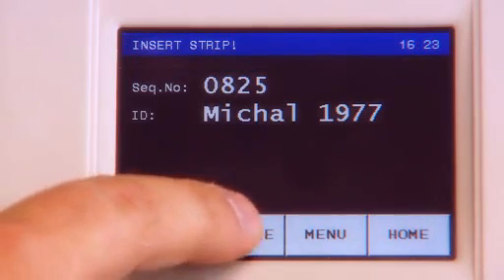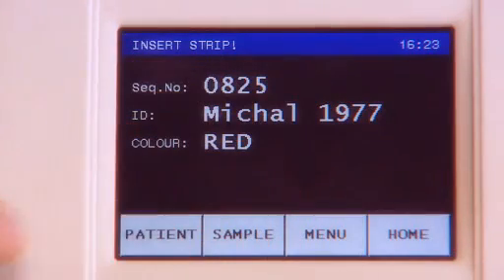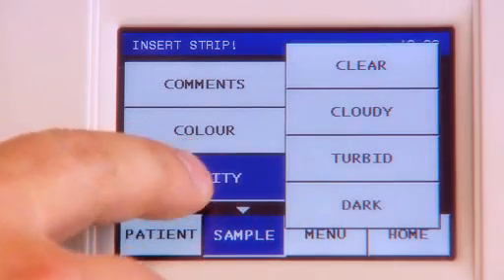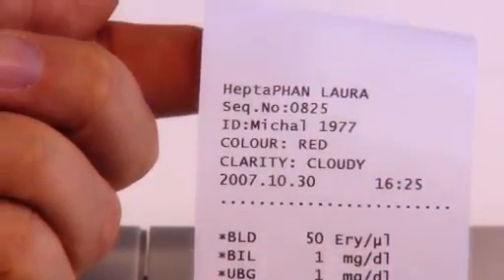The machine has a rich user interface and colour touchscreen, which allows maximum adjustment for the individual requirements of urine analysis. The last 240 measurements can be recalled from the memory. A useful feature is the ability to enter the colour and clarity of the sample, and also the optional attachment of text to a selected sample.